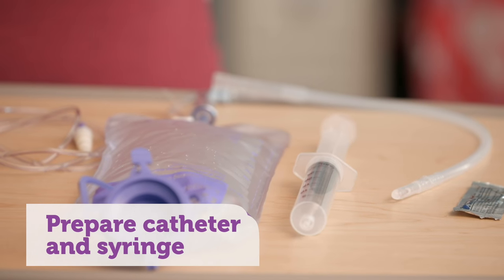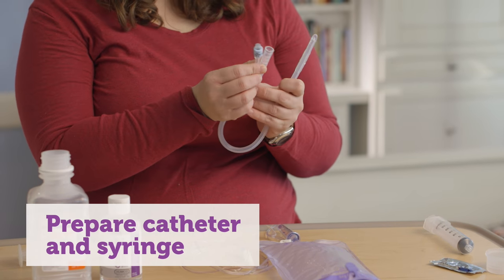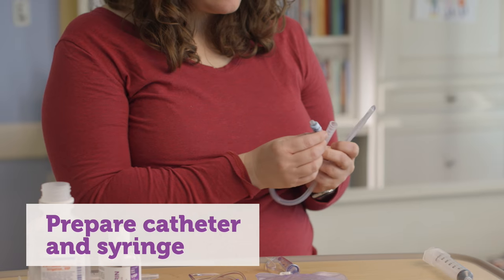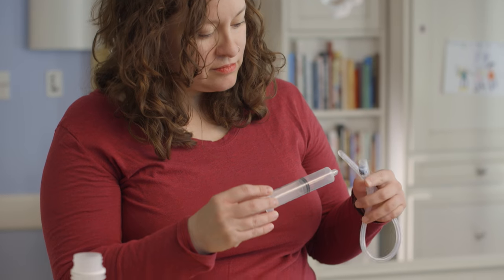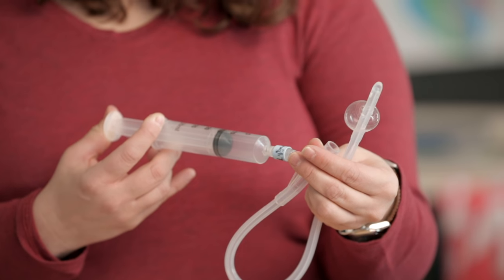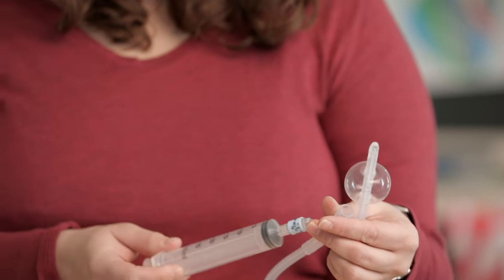Then prepare the catheter and a syringe. The catheter has two ports on the end — one is used for the solution and the other is used to inflate the balloon at the end. The balloon helps the catheter stay in the rectum during the enema. Pull back 15 to 30 milliliters of air in the syringe and place the syringe on the balloon port. Test the balloon by pushing air into the port and watching the balloon inflate or fill up. If the balloon inflates well, remove the air from the balloon and prepare your child.